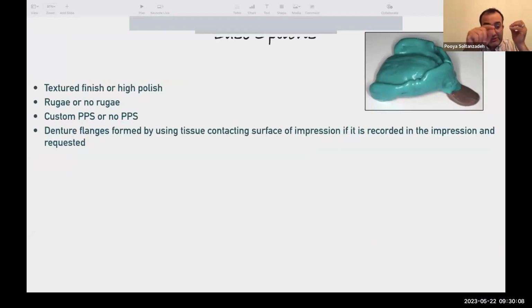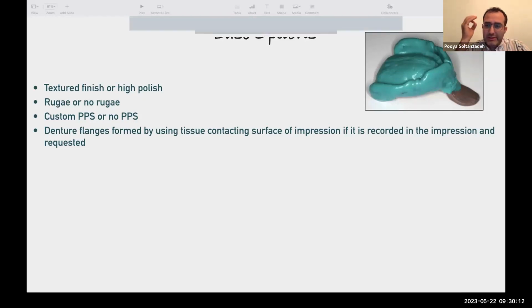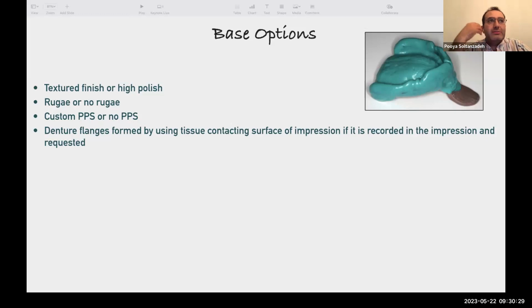One of the advantages that I forgot to put in here is that milled dentures are usually a little lighter and thinner, but also much stronger. And patients feel much better about it, especially about the palate. You can request them to go with minimal thickness on the palate, and they feel like, oh my God, it has a better fit. And the patient really appreciates it and can differentiate it, sensing wise.